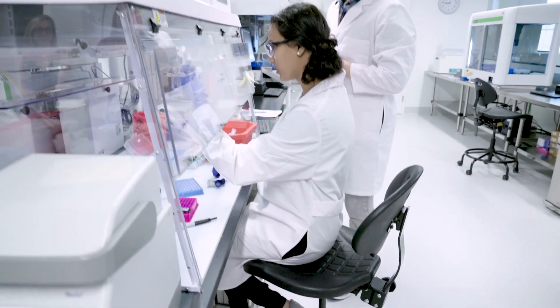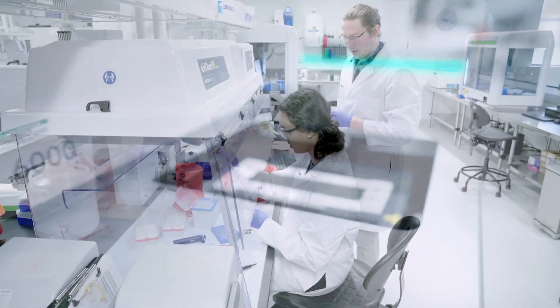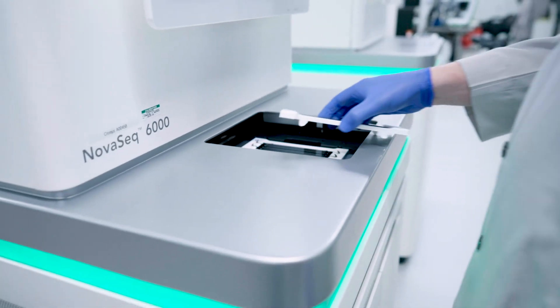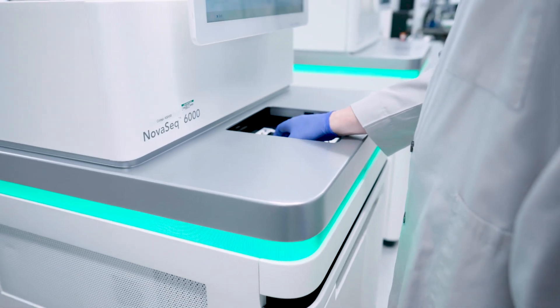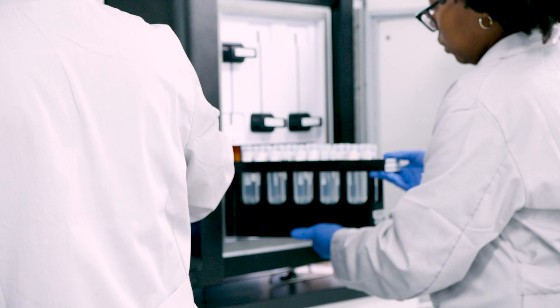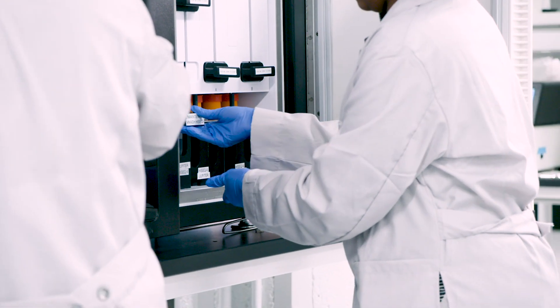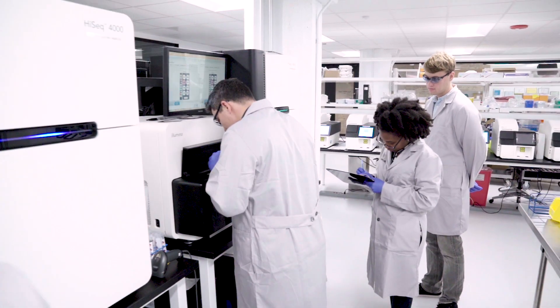In our CAP-accredited and CLIA-certified lab, we're able to provide high-quality sequencing services at industry low pricing to ensure every patient who should be sequenced has access.